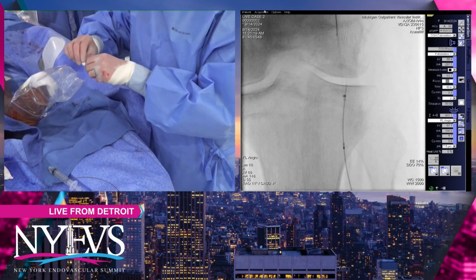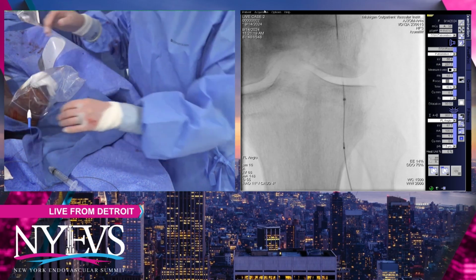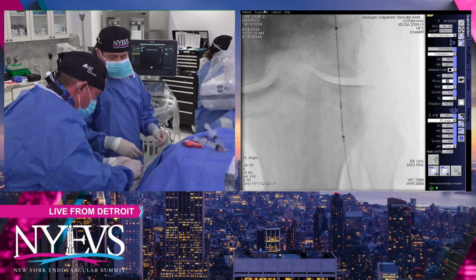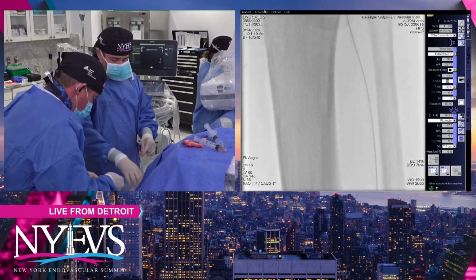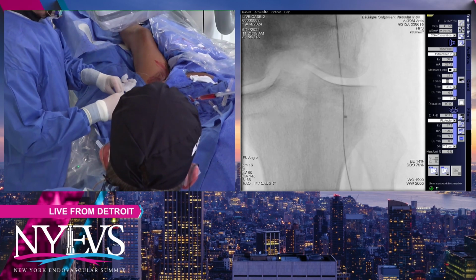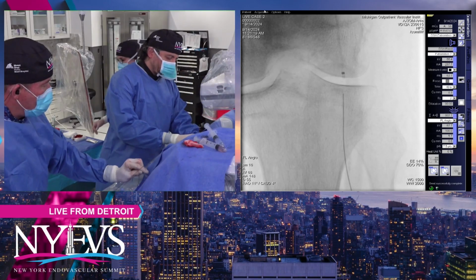And so I think it violates a basic principle of revascularization. Couldn't agree with you more. I'm not saying there aren't times where it's appropriate to do it, but as a routine, it doesn't make as much sense. Now, you could argue that if you're skilled with duplex ultrasonography and you have your interventional tech, your completion imaging could be a duplex ultrasound down to the wound. But I just don't buy that, and I don't think most people are actually doing it.